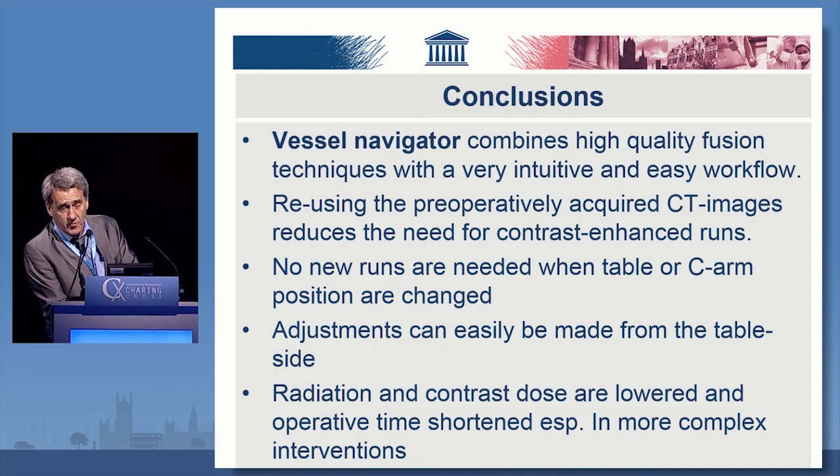With a classical roadmap system it is necessary, of course. Adjustments can easily be made from the table side, and therefore radiation and contrast dose are lowered significantly, operative time shortened, certainly in more complex interventions. I thank you for your attention.